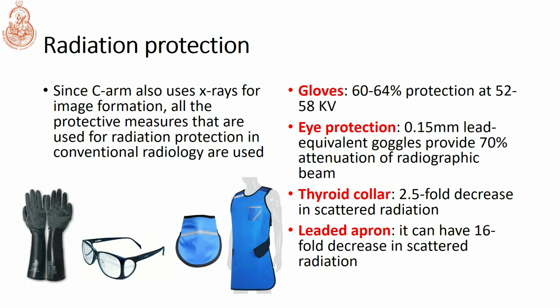As we started by saying, the C-arm uses the same principles of X-rays, except in one thing, that the X-rays are being pumped out from the X-ray tube continuously. So, that makes the C-arm more dangerous than the conventional radiographic technique.